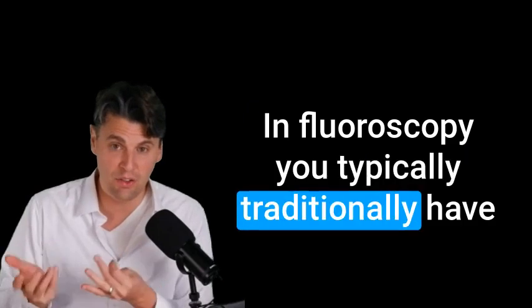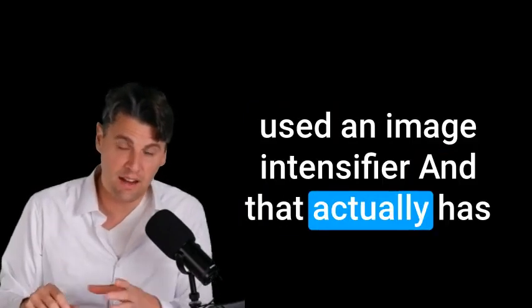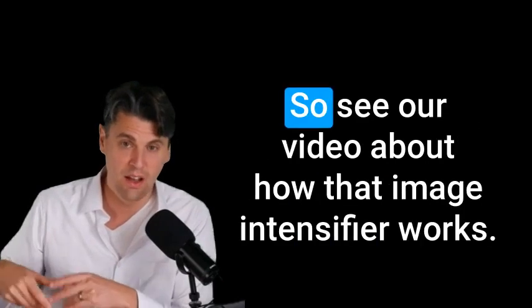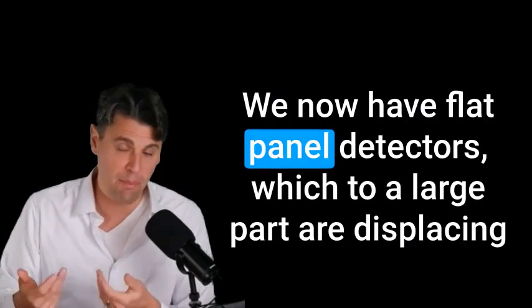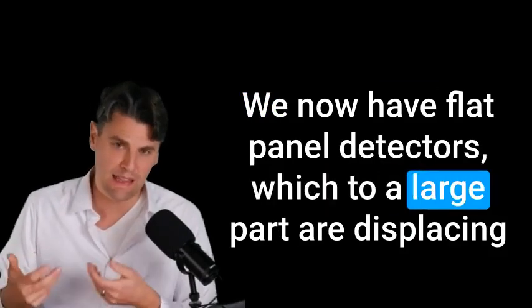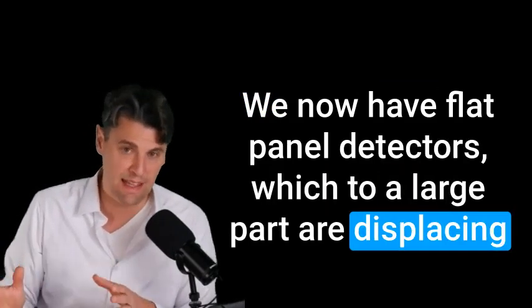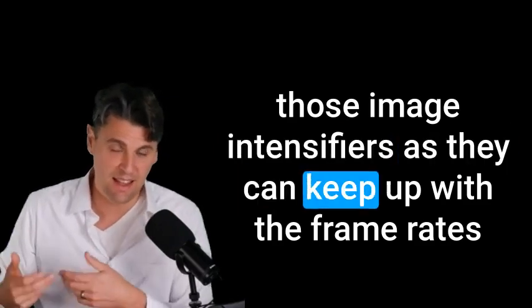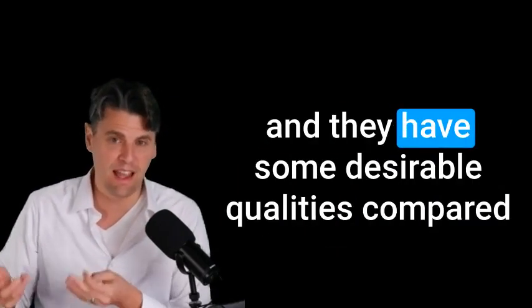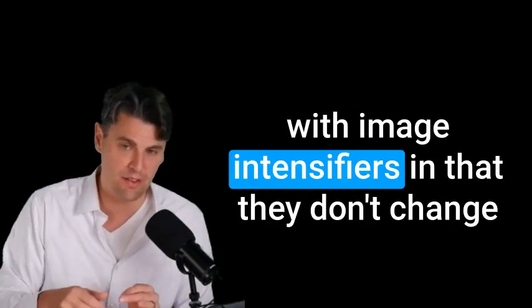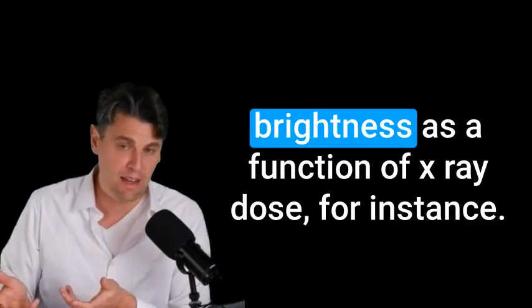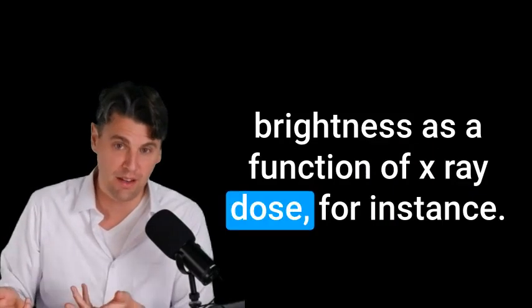In fluoroscopy, you typically, traditionally have used an image intensifier, and that actually has electron optics inside of your image intensifier. So see our video about how that image intensifier works. We now have flat panel detectors, which to a large part are displacing those image intensifiers, as they can keep up with the frame rates, and they have some desirable qualities compared with image intensifiers in that they don't change brightness as a function of x-ray dose, for instance.